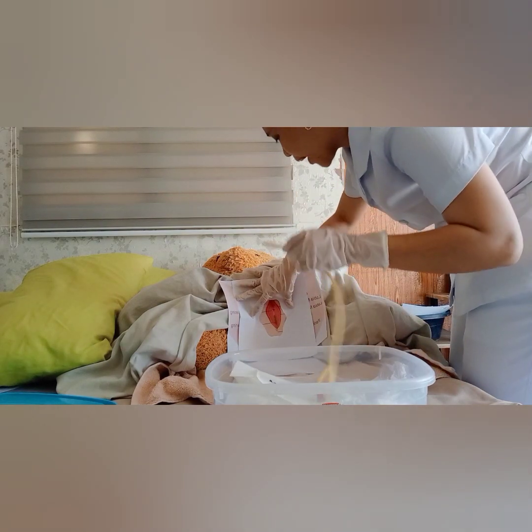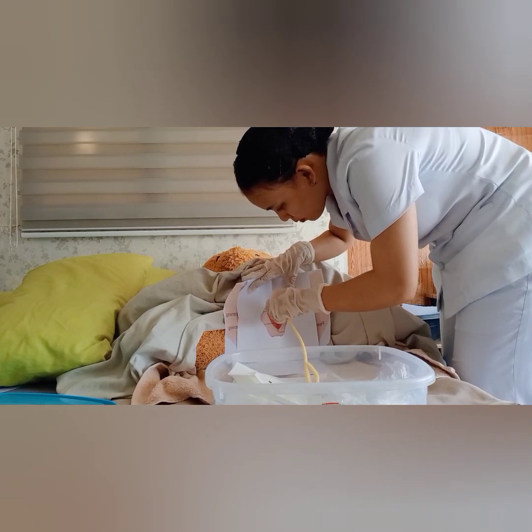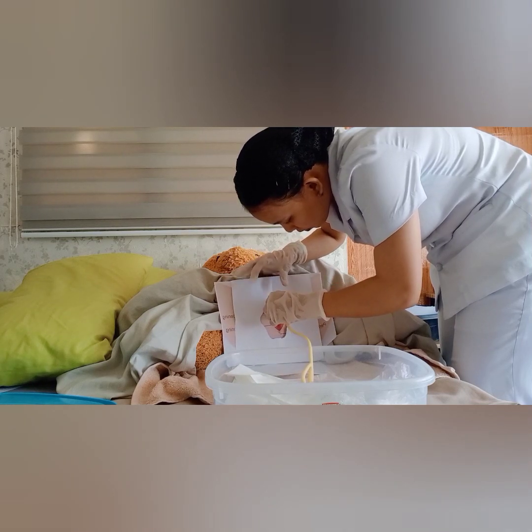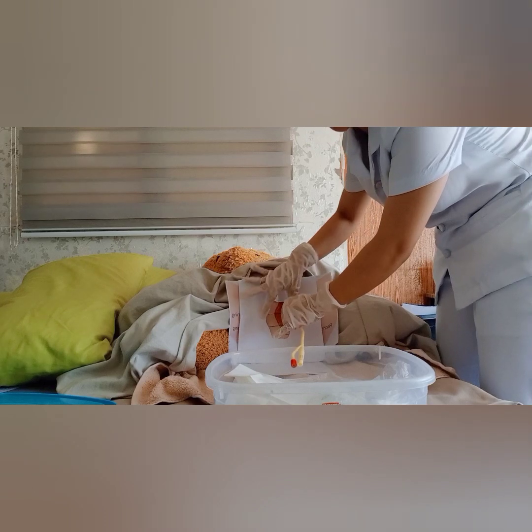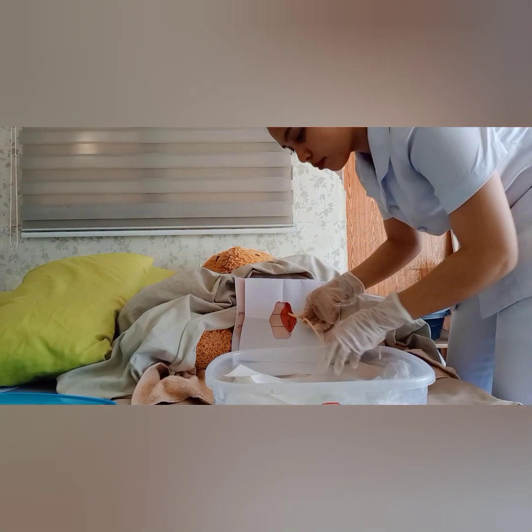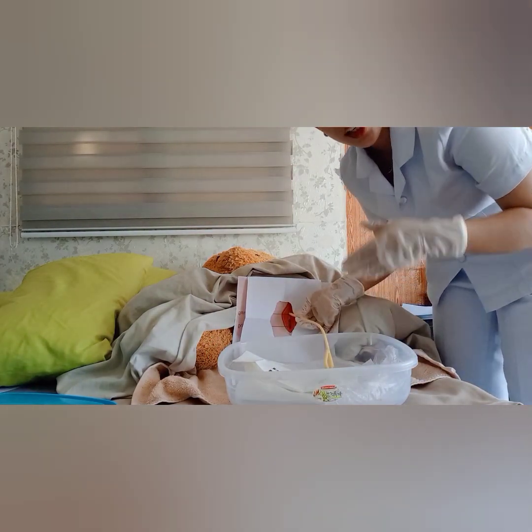Ma'am, Nanay, I will now insert the catheter, okay? Nanay, are you feeling alright? Okay, that's good to know. So the rationale for that is to relax the sphincter in order to facilitate the insertion of the catheter. So if the specimen is being collected, pinch the catheter with the thumb and finger while placing the specimen container in position. Okay, so the rationale for that is so that the urine doesn't leak out.